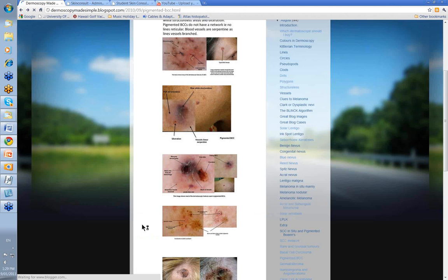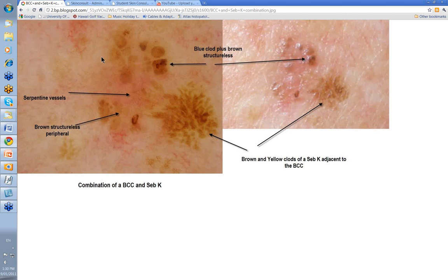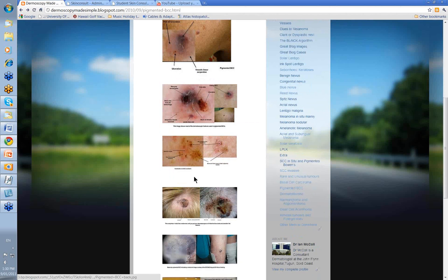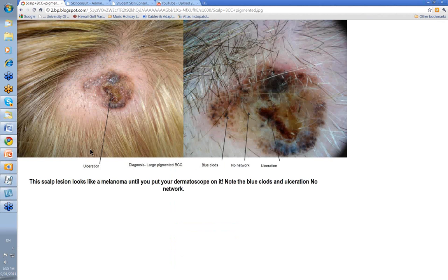The thing I've had difficulty showing you so far has been brown structureless peripheral. These used to be called leaf-like areas, and this is what they're supposed to look like. This case was a combination of a seborrheic keratosis with a pigmented BCC — pink, blue and grey areas within it. This is your Seb K here, and this is your BCC. This brown structureless peripheral is what you'll often see in pigmented basal cell skin cancers. Lines radial peripheral meeting at a point used to be known as spoke wheels because they're highly specific for pigmented BCCs.